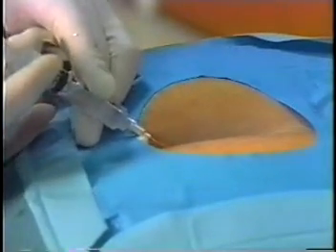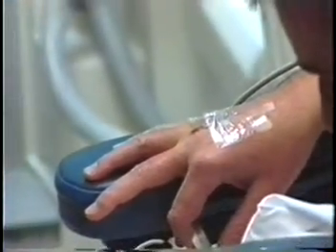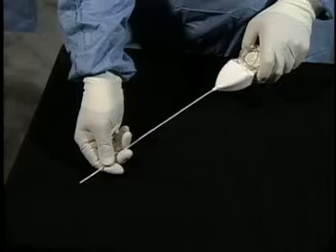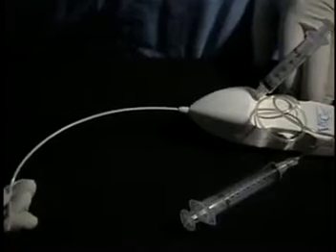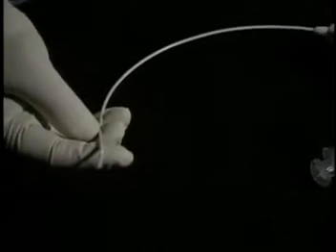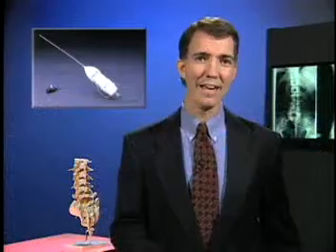The procedure is performed with local anesthesia. Intravenous sedation may be added if necessary. A soft, steerable catheter, less than two and a half millimeters in diameter, is used. The steerable catheter contains a passage for the fiber optic endoscope and the injection of irrigation fluid and medications into the spinal canal. The catheter enters into the spinal canal at the lowest part of the spine near the tailbone. Images of the inside of the spinal canal are displayed on a video monitor. Permanent images can be made if needed.